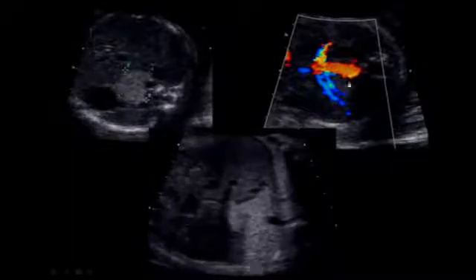Another small echogenic mass. Now, sometimes these echogenic masses are found in the upper abdomen rather than at the base of the lung. So here in the upper abdomen, immediately next to the stomach, we have stomach here, we have spleen here, and then there's this well-defined echogenic mass that's almost surrounding the aorta. We put on the color Doppler and we can see the blood supply is coming right off the aorta, two vessels actually coming into this area of sequestration.